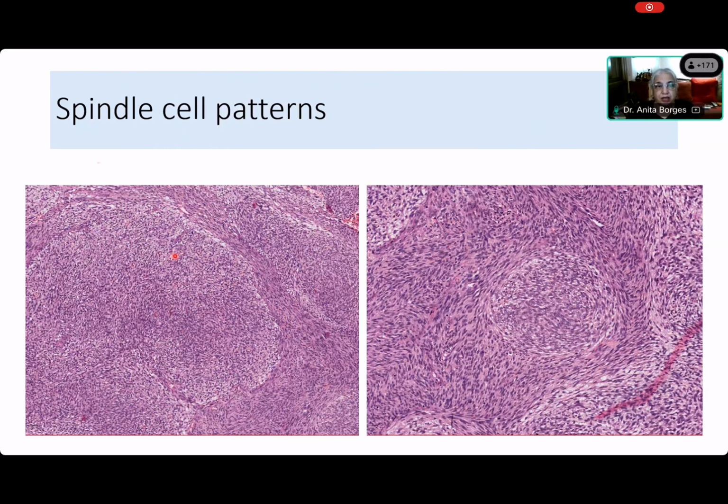They probably are fascicles, right? But what has happened to them? Like what we saw. Look at this thing. We saw it where Shashank was saying, no, these are not spindle cells, because he didn't see the spindle nuclei. So why are you not seeing the spindle nuclei over here, Priyamada? Ma'am, these are, I think, transversely cut. So they're transversely cut. Now in your mind, you should understand that these are all fascicles. Yes, they are all fascicles, but in these particular slides, you are seeing some fascicles that are cut longitudinally, some are cut obliquely, and some are cut transversely.